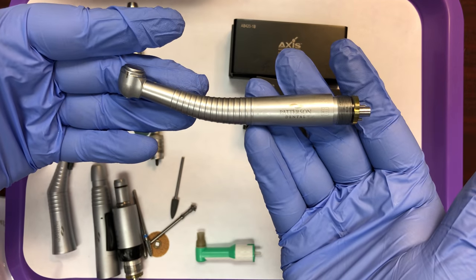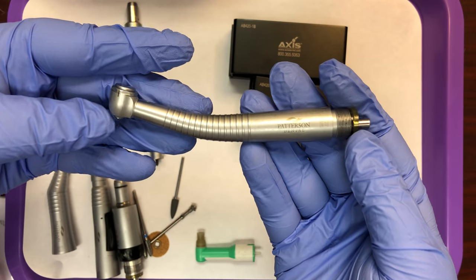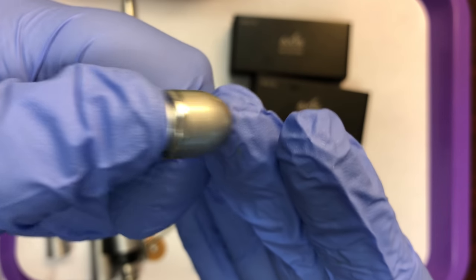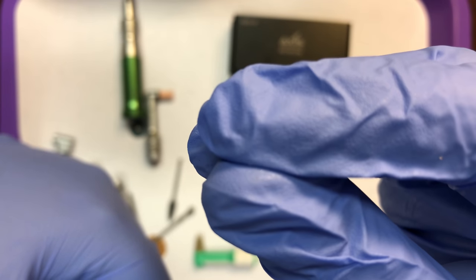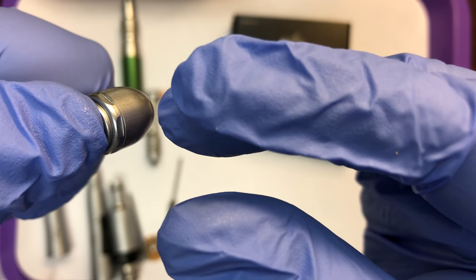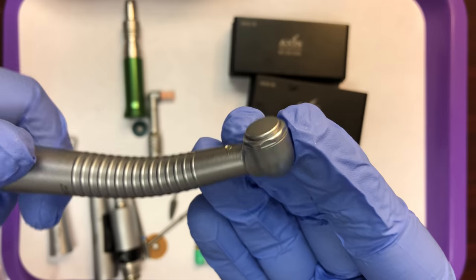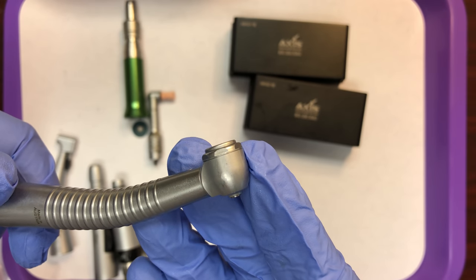Here we have a high speed hand piece. High speed hand pieces are one unit from the coupler — where they attach to the hoses — all the way to the working end. This one has a push button locking mechanism. To open up the lock, you press firmly on the back of the head, and that opens up the mechanism inside. The mechanism inside is automatically in a closed position. Pushing on the back opens it to receive the burr, and when you release, the mechanism closes. This is a friction grip attachment — so the only burrs that will fit into the high speed hand piece are friction grip burrs.